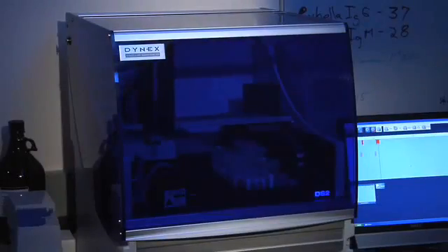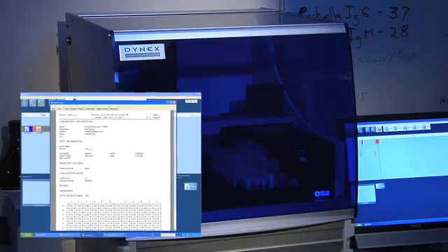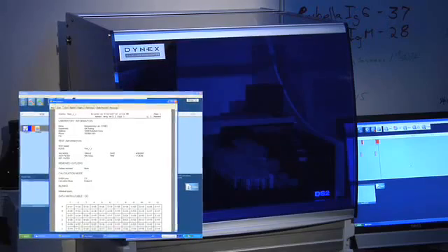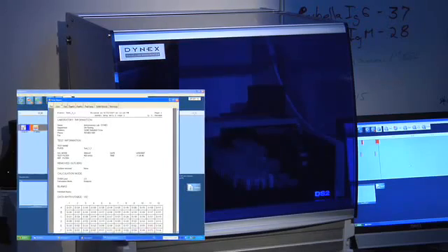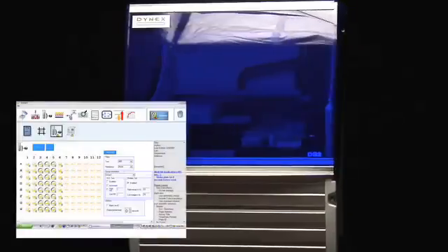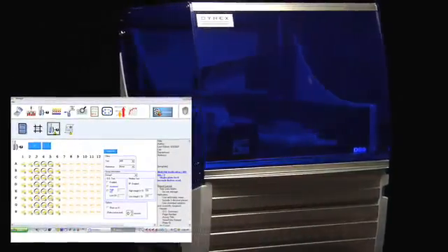The DS2 delivers worry-free results, assay to assay, operator to operator, day in and day out. In-process quality control is provided by well-filled verification to ensure critical fluid dispensing.